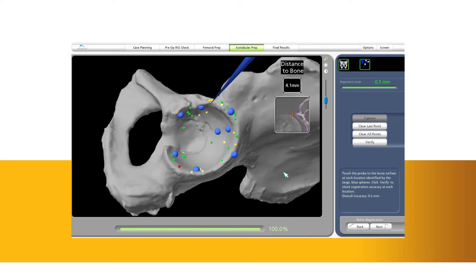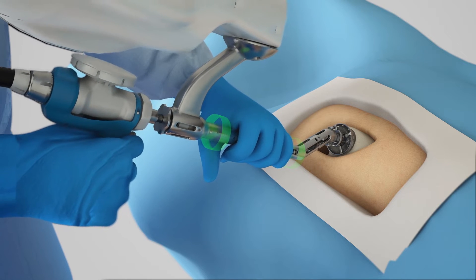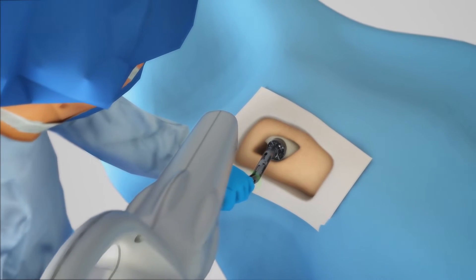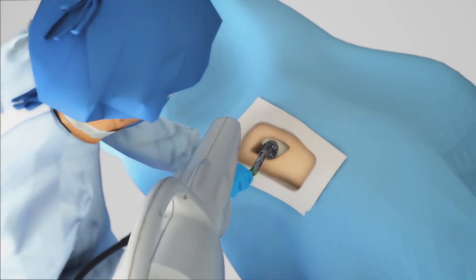Once the anatomy is registered to the 3D model, the surgeon has the flexibility to modify the preoperative plan based on their assessment of the patient's anatomy. Then, the surgeon guides the robotic arm to remove the arthritic bone and cartilage from the hip. A virtual boundary provides tactile resistance to prevent the surgeon from removing more than just the arthritic bone identified in the preoperative plan.